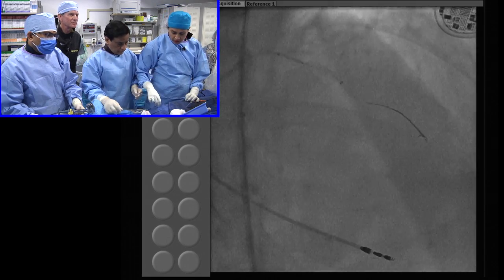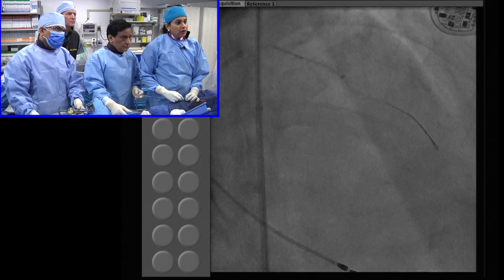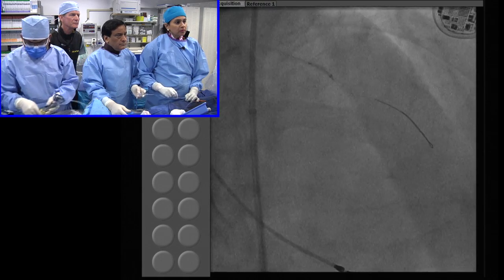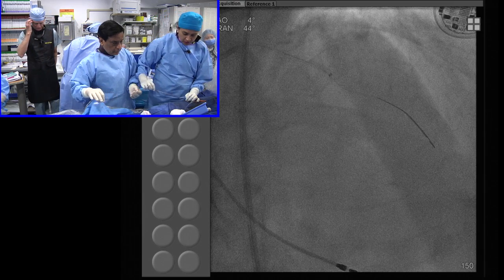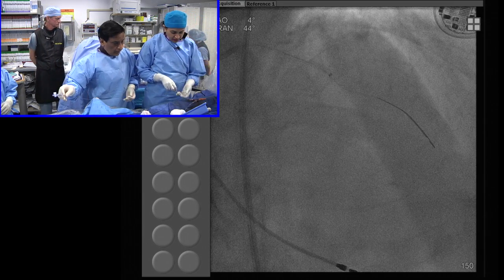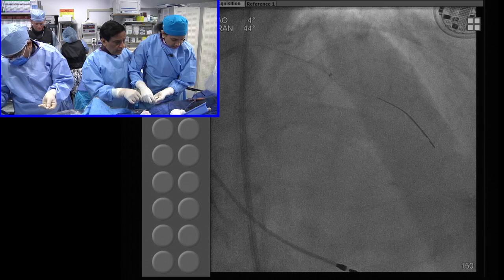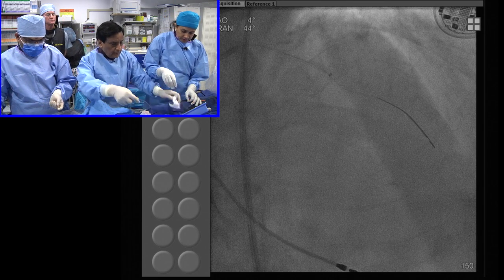Wow. The guide liner's way down now. You want to really do it, then you have to go and suck it more. Okay. Get the balloon again. You change to the other one, it will fly. We need a new balloon. I'm saying a new stent. No, not yet. Okay. So we are going to go get the guide liner a little further, which is okay.